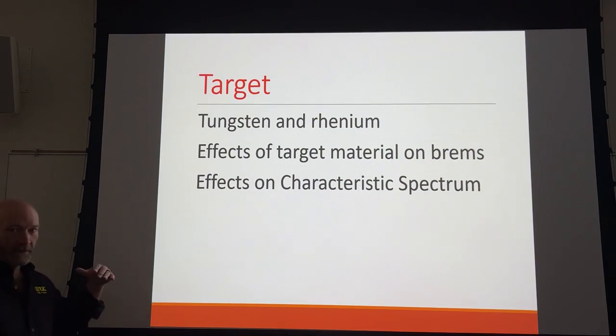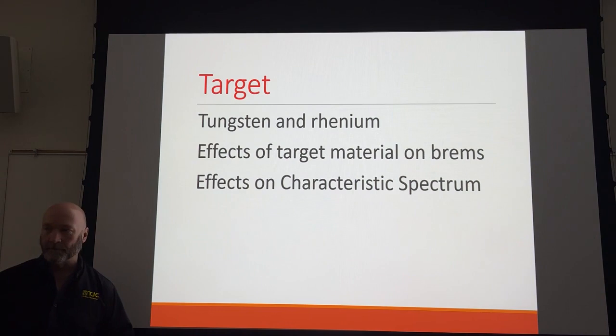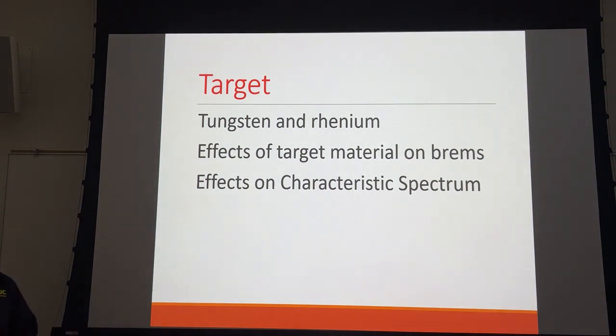Now, before we press onto this, is there a time to hold the prep button down? Are there legitimate examples that you can think of when we need to be on that prep button longer than just that 1 second to get the anode up to speed? Kids, bingo. Kids, you got a screaming kid. If you're not on that prep button, you're not going to get a full inspiration. So kids, if you're in surgery, and I understand most of your surgeries are done with C-arms now, but if you happen to be working somewhere where you're doing plain film radiography with an image receptor, it's not really film, but with an image receptor, you may need to be on that prep button.